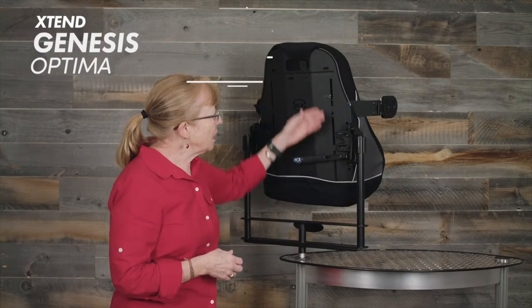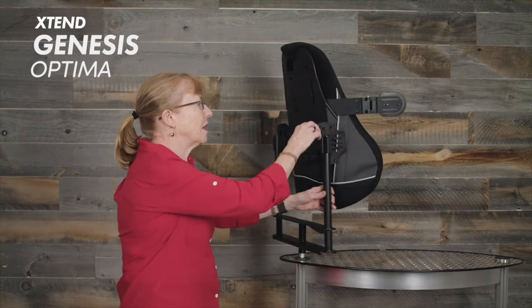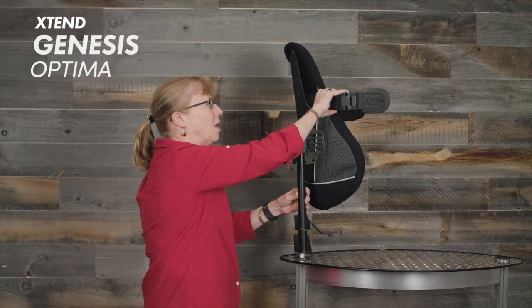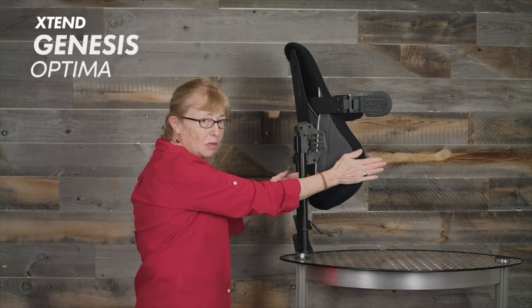On all the backs, we have the slots for the external lateral supports. These are not attached right now, but just to show you — I can have it go up or down depending on where I need the support. I can actually have it all the way down here and coming out here.